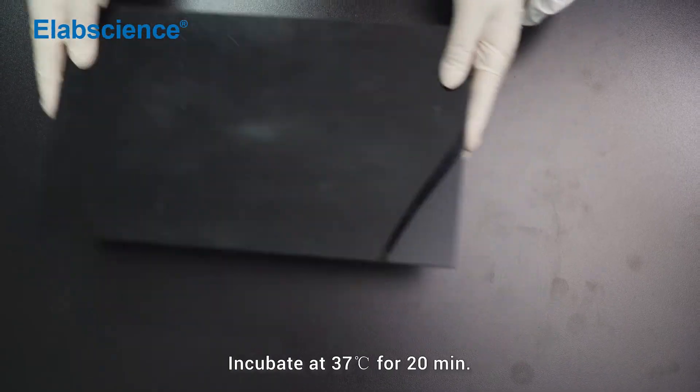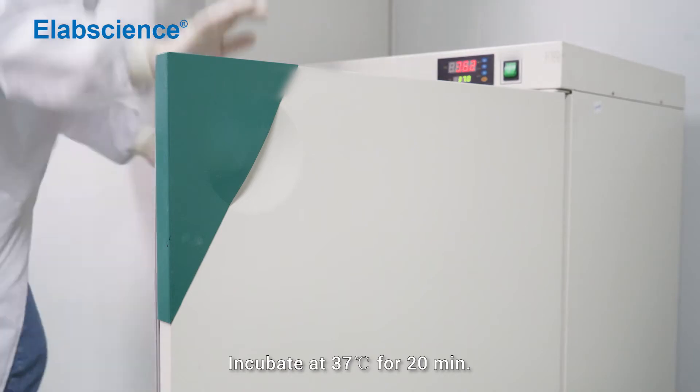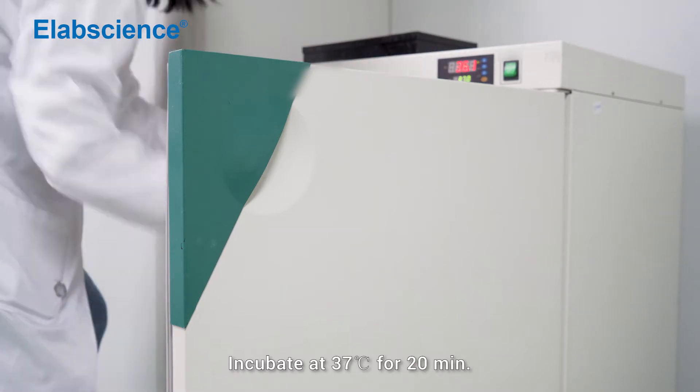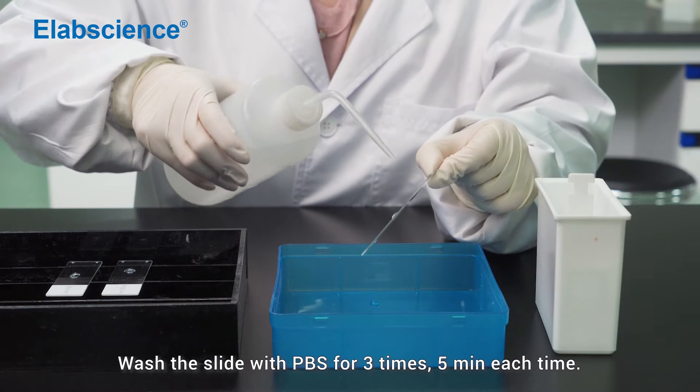Incubate at 37 degrees for 20 minutes. Wash the slide with PBS for 3 times, 5 minutes each time.